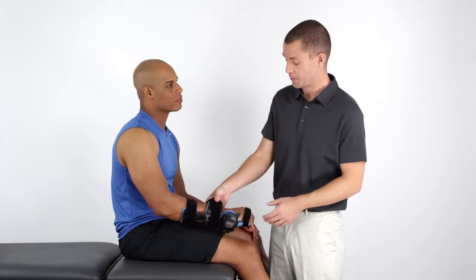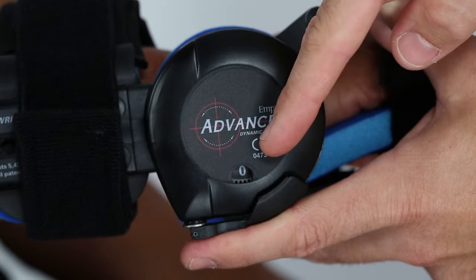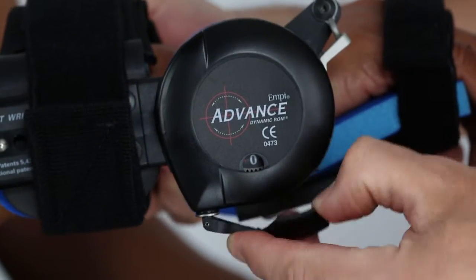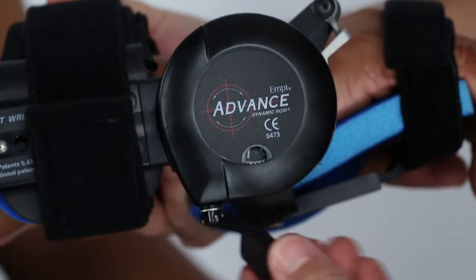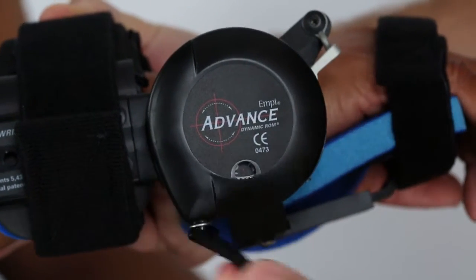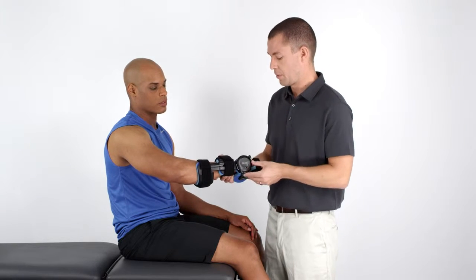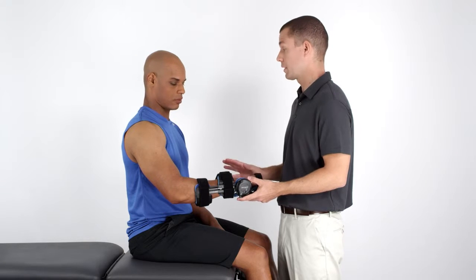When you adjust the tension, make sure that the lock lever and safety are in the locked position. Then check the tension indicator window to verify that it's set at the correct current tension level. The numbers appearing in the indicator window start at 0 and increase to 10, with each number representing an increased level of torque. At the initial fitting, set the tension level at a very mild pressure that is comfortable for the patient and instruct the patient to wear the orthosis for 1 to 2 hours.